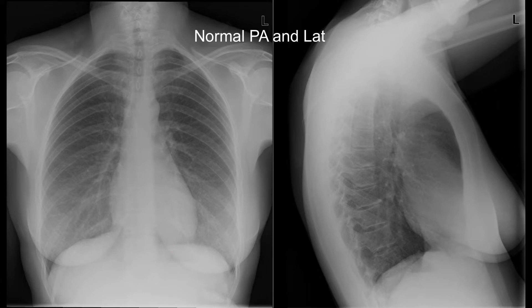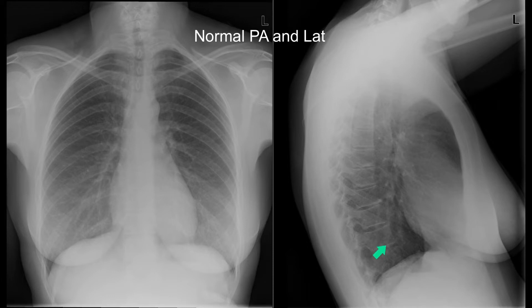On the lateral view, the important thing to note is that in normal patients, the density of the spine reduces as you go from top to bottom. This is because there is more lung to go through before hitting the cassette plate.